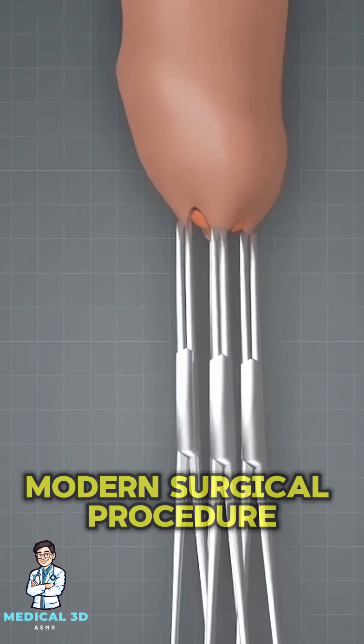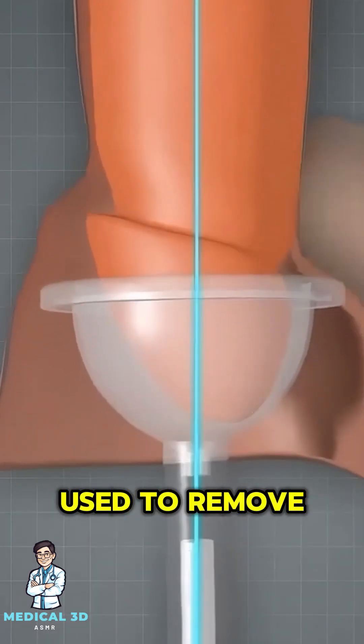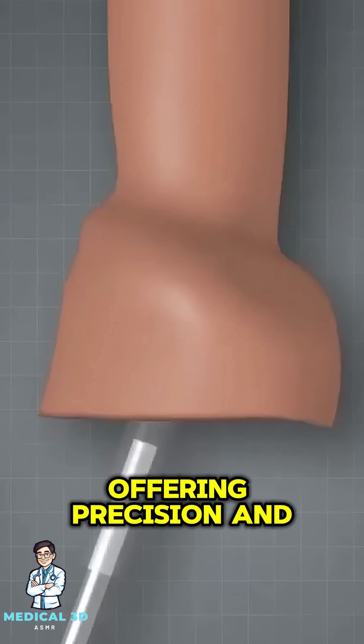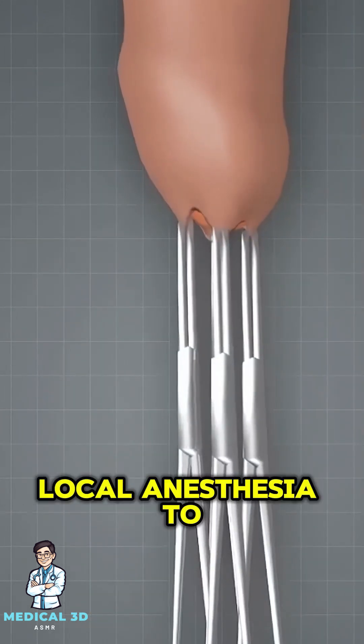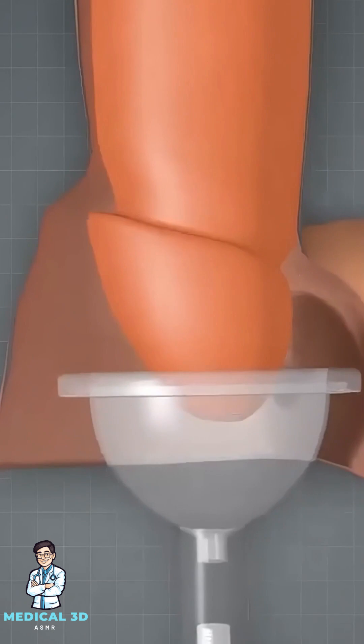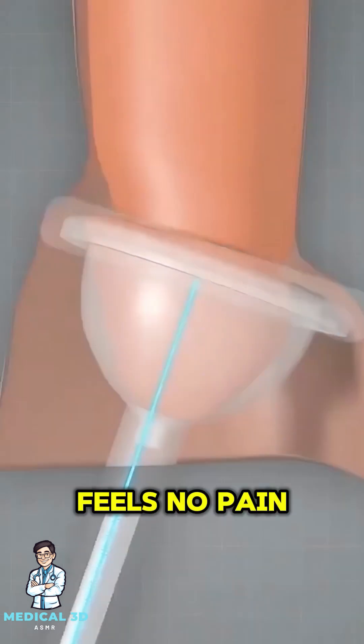ZSR circumcision is a modern surgical procedure used to remove the foreskin, offering precision and faster recovery. It starts with local anesthesia to numb the area, ensuring the patient feels no pain.